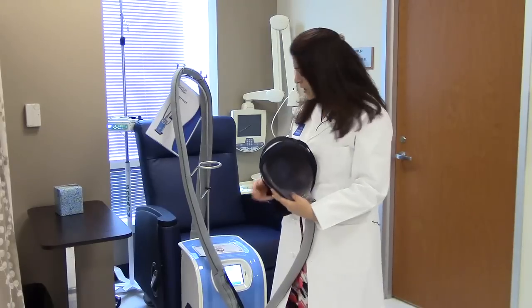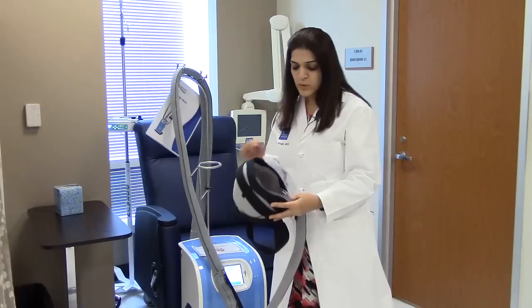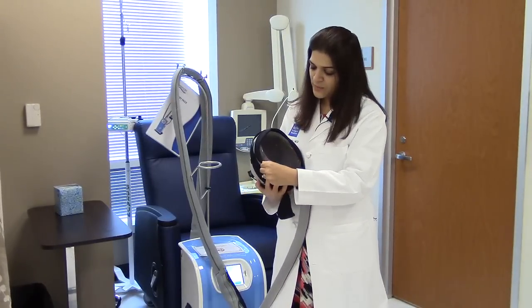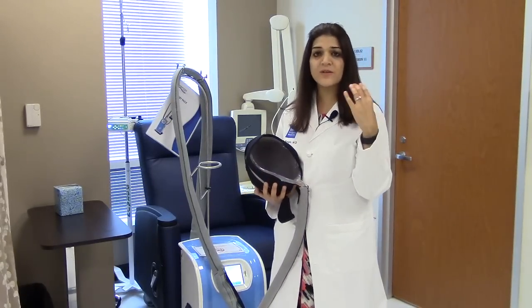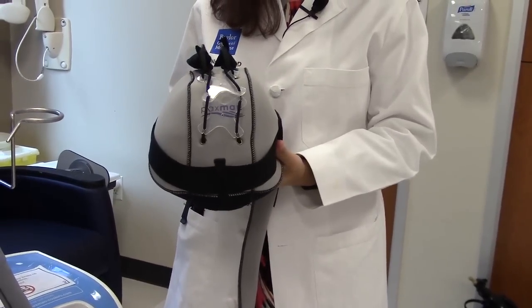prevents hair loss. This unit is basically a mini refrigeration unit and will circulate the fluid in the cap. The outer cap makes sure that there's a tight fit on the scalp so that the scalp stays cold, which will prevent hair loss.